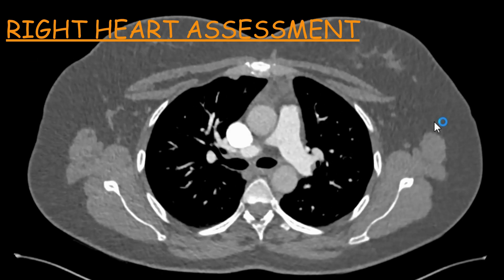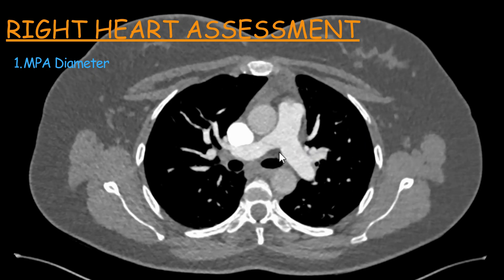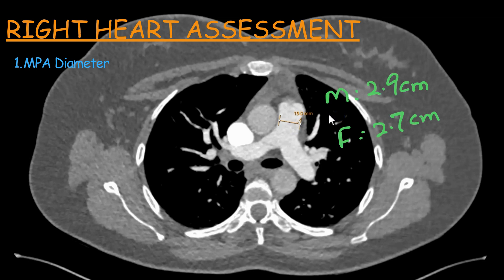How to assess elevated right heart strain? There are several things we can measure to evaluate the right heart chambers. One is the diameter of the main pulmonary trunk. To measure it, you choose a slice where the division into right and left main pulmonary artery is shown at the same level as the main pulmonary trunk — this is the ideal image. Then you measure the distance. In this patient it's about 1.9 centimeters. The normal upper limit is generally about 2.9 centimeters in males and 2.7 centimeters in females, but there can be a lot of variation.